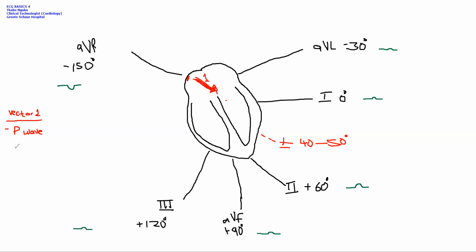Then when it comes to vector 2, vector 2 is septal depolarization. Now, literature says that septal depolarization is always occurring from left to right. The reason being that somehow the left bundle conducts faster than the right bundle. So you have faster conduction down the left bundle and you have left to right activation of your septum. Okay, so this is before we get to the Purkinje system.